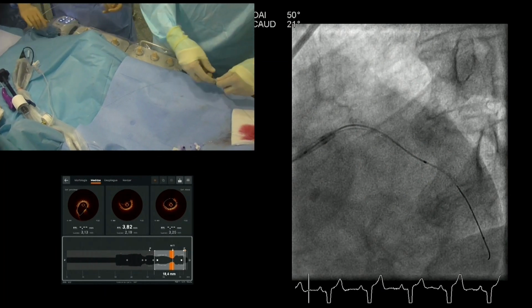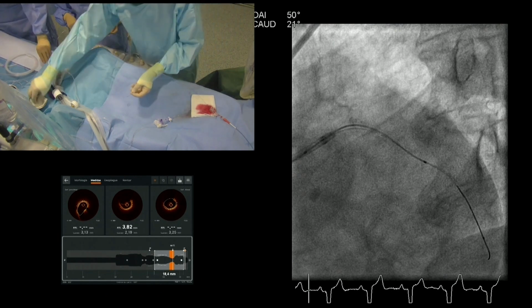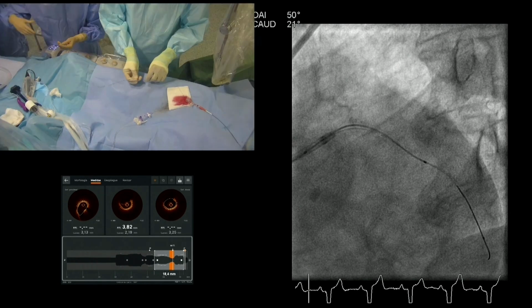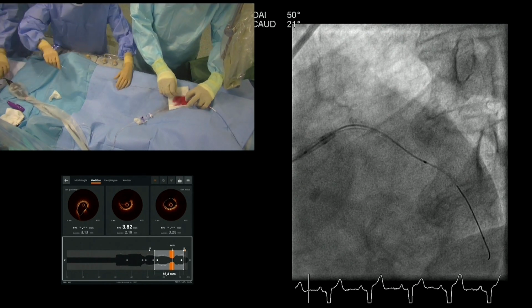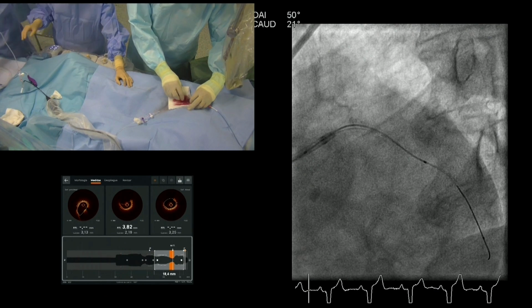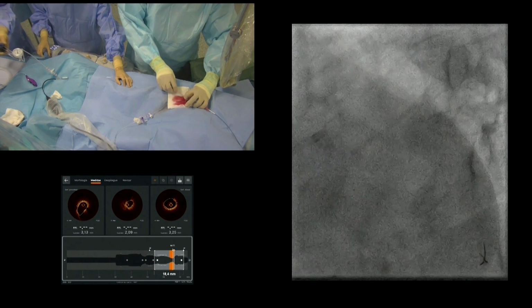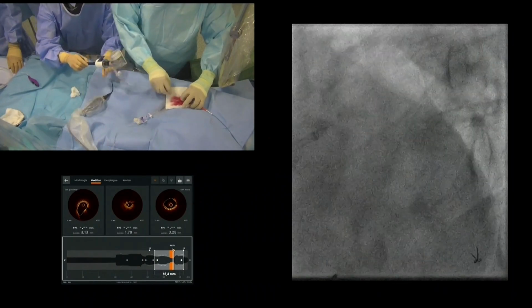Because we have concentric calcification very thick, it looks like a very good type of lesion for using lithotripsy. And we have seen that we have been able to advance the previous wire, so let's see how the IVL balloon goes here. So Nieves, let's try first to advance the system without guiding catheter extension. Yeah. Of course, we have to remember, and this is something interesting from what we saw, if we want to advance the guiding catheter extension, we have a calcific nodule in the ostium of the circumflex, which may be a small obstacle. So, knowing this type of information will improve the safety of the procedure.